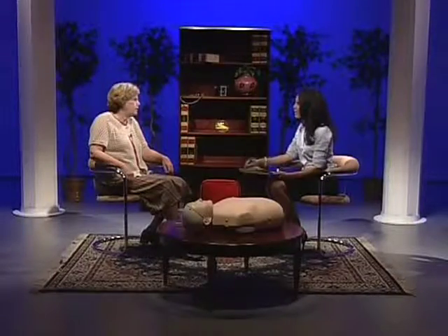Okay. So can anyone buy an AED? Could I, as an individual, say, go online and buy an AED for myself? Well, you could probably buy one on eBay, but I wouldn't recommend it. Actually, in Kentucky, AEDs are considered a piece of medical equipment. So you would need to have a physician write a prescription for an AED.